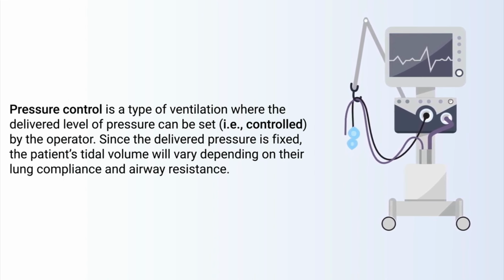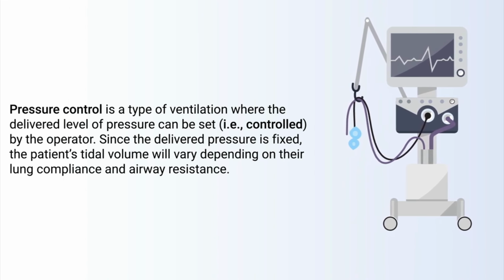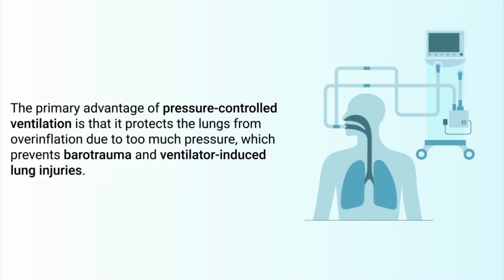Since the delivered pressure is fixed, the patient's tidal volume will vary depending on their lung compliance and airway resistance. The primary advantage of pressure-controlled ventilation is that it protects the lungs from overinflation due to too much pressure, which prevents barotrauma and ventilator-induced lung injuries.